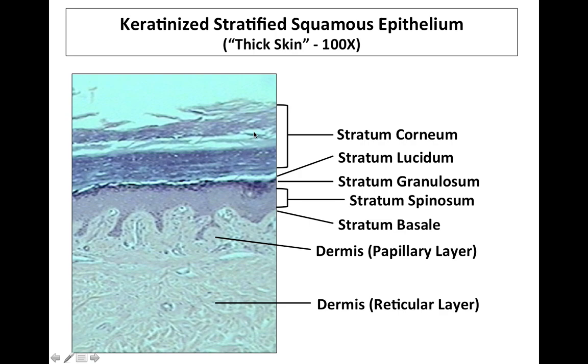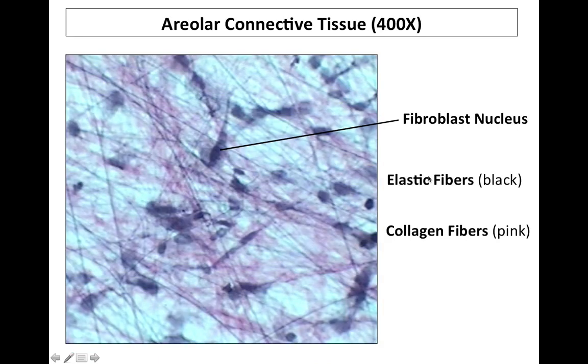Now, you will notice in the images that sometimes these cells of the stratum corneum begin to separate because of the keratinization, so they don't stick together as well. So there are certain spaces that begin to appear, and you start to see these dead cells begin to flake off. Don't let that confuse you. Start to use your stratum granulosum as a key point for representation. Look for that dark line in order to indicate the location of stratum lucidum to you. That's the end of epithelial tissue.